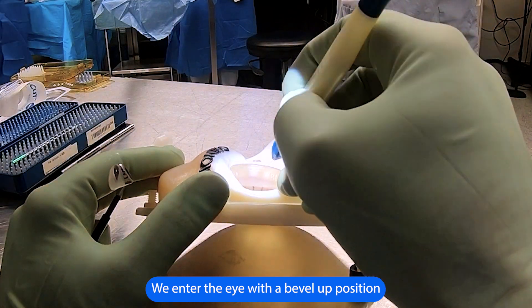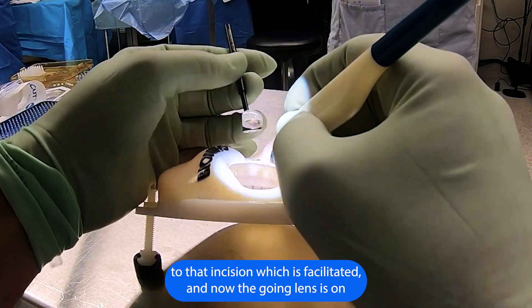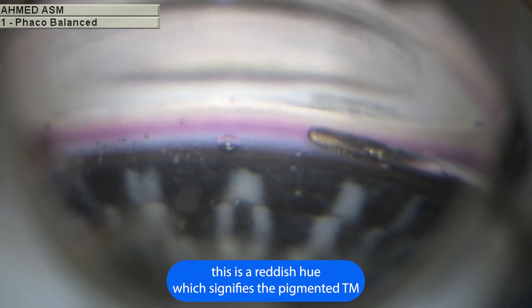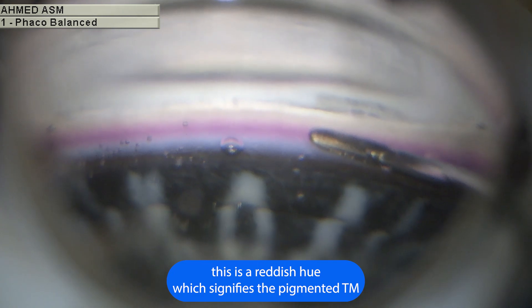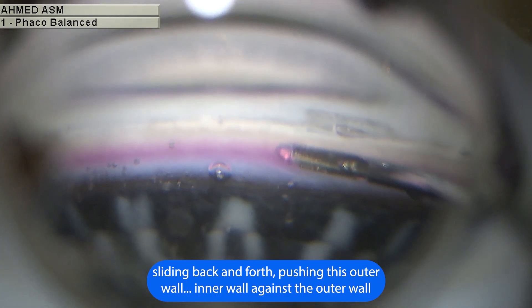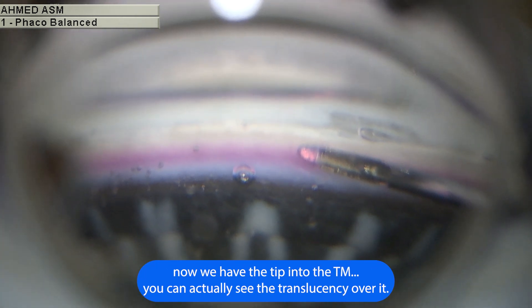We enter the eye with a bevel up position through that incision, and now the goni lens is on. We can see a nice view of the trabecular meshwork. This is a reddish hue which signifies the pigmented TM, with non-pigmented TM just superior to that — sliding back and forth, pushing against the outer wall, inner wall against the outer wall, and now we have the tip into the TM.